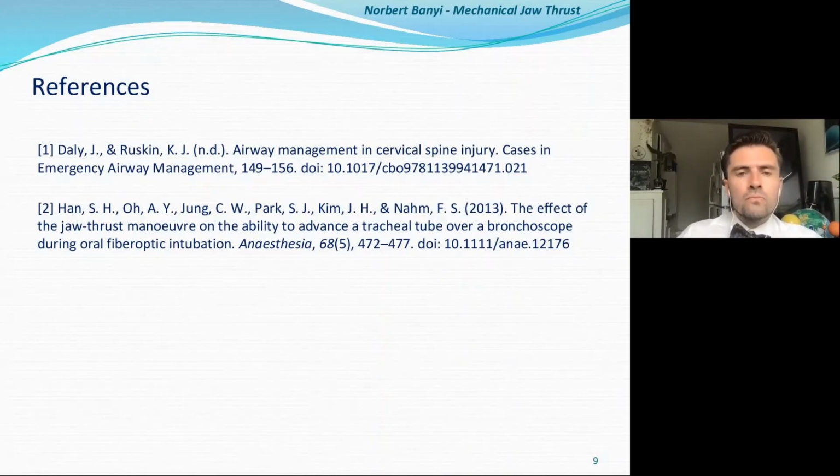And if any of these complications arise, the sides of the device can rip off, and any kind of control that the operator would now do, such as a surgery or something like that, can be done as it would be otherwise.